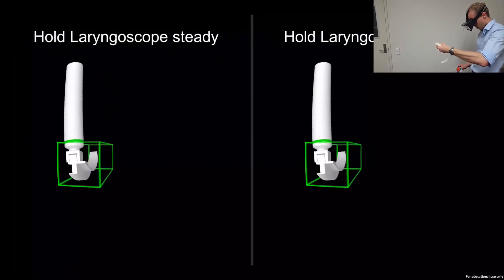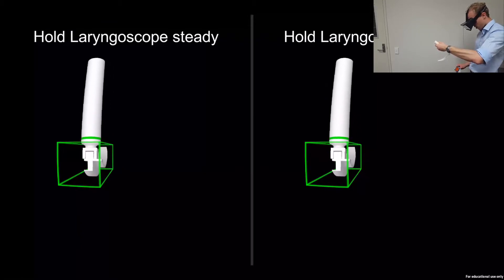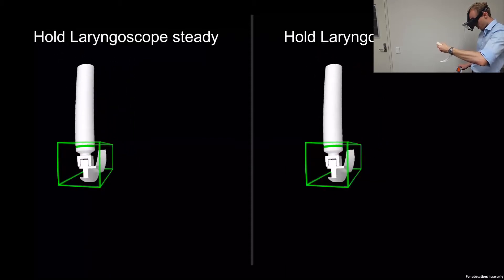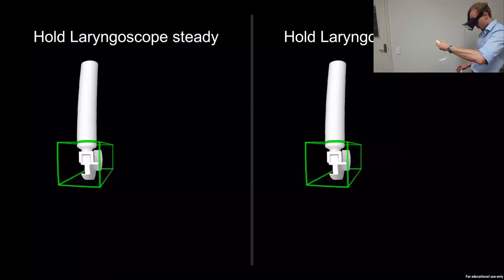Try moving the laryngoscope. The guide has now turned green to indicate that you are correctly positioned. If for any reason you incorrectly attempt part of a simulation, the guides will turn red, allowing you to quickly readjust to them. If you take too long to readjust, the simulation will reset.